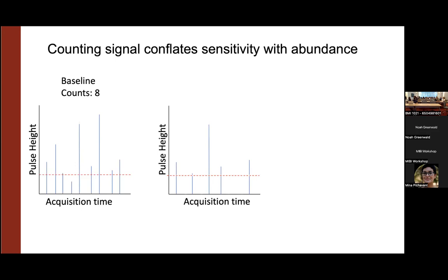However, let's say you had some different sample that was just sparse. There were fewer cells, the person designing the TMA missed the region they were supposed to be looking at, it's a very small biopsy, whatever the reason is, there's just less true positives. What this would look like in this low abundance sample is that there would be fewer counts. But that's expected. Nothing needs to be corrected here. It's just a sample with less stuff in it.